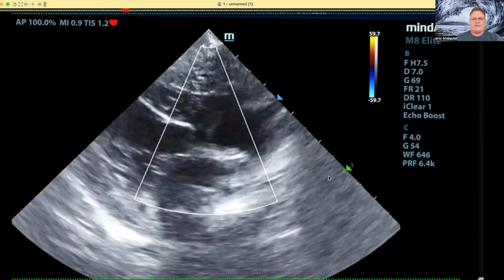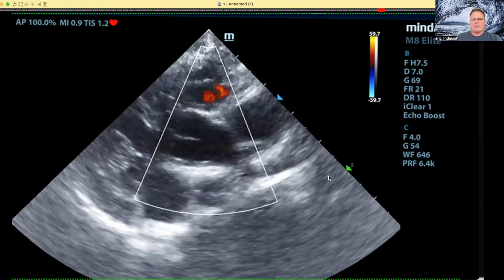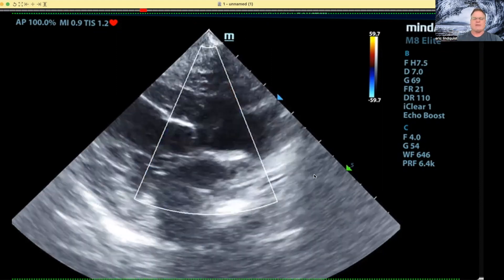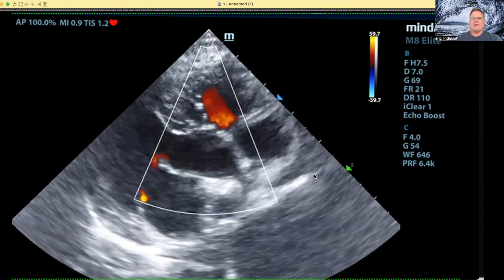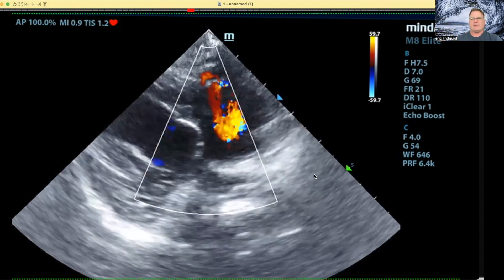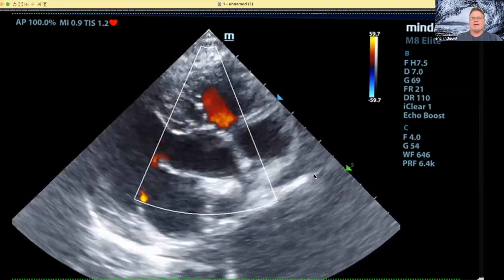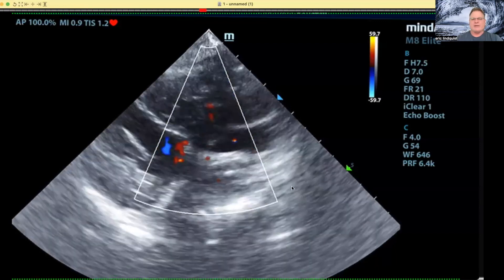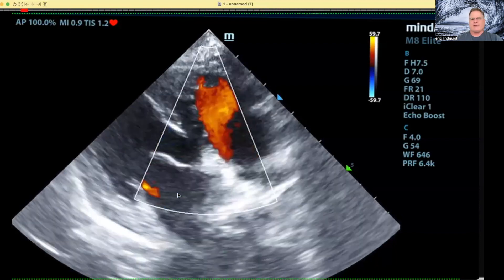Hey everybody, Dr. Eric Lindquist here with some quick tips on our Sono Minutes. I'm going to pop over to the heart and give you some quick tips that we run into all the time. If you have a coughing dog with a heart murmur and you need to know — is this a cardiogenic cough or not? Just from an ultrasound perspective, obviously we want radiographs and ideally CT, but do you need to know in a hurry? In dogs we have this typical four-to-five chamber efficiency clip.